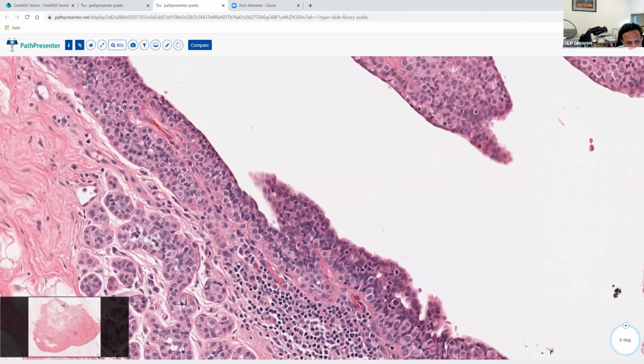So in that case, while you may still not want to call these small foci DCIS on core biopsy, you don't want to overreact to anything. You can suggest that there are these small ducts involved in a Pagetoid fashion by atypical cells that show ductal differentiation and a supporting staining pattern with E-cadherin and P120 stains.